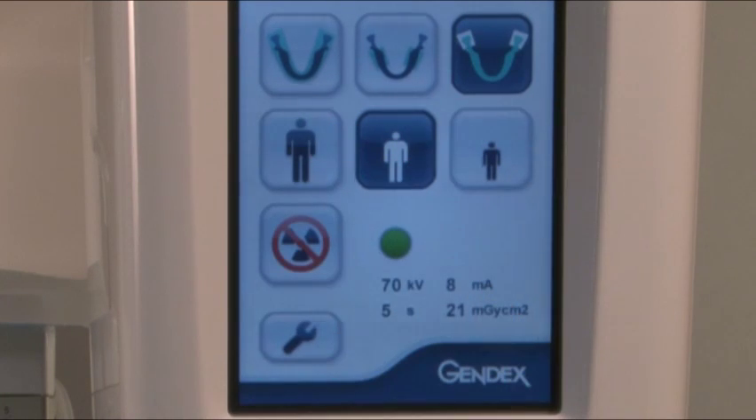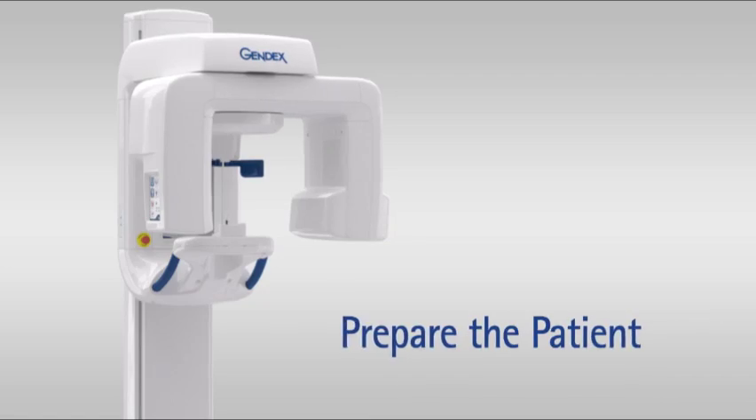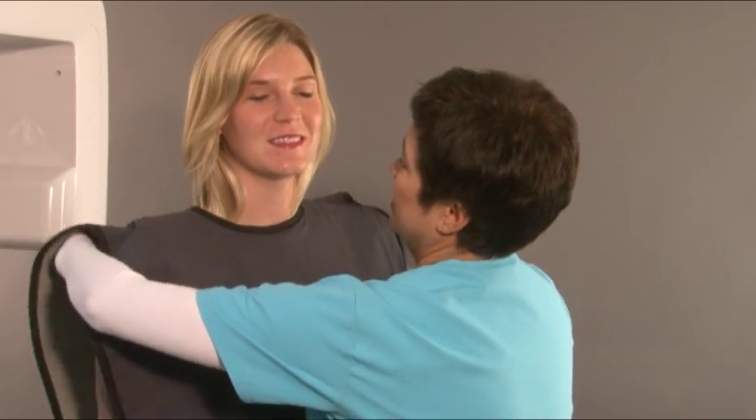Select the TMJ projection and patient size. Prepare the patient by asking them to remove any glasses, false teeth, jewelry, hair clips, and pins. Place a protective lead apron over the patient's shoulders.